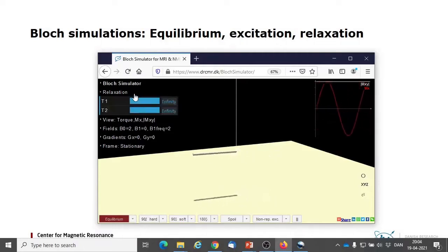Setting T2 to 6 seconds, for example, makes the transversal magnetization decay away on this timescale. Setting T1 to 8 seconds makes the longitudinal magnetization independently approach M0 on this longer timescale.